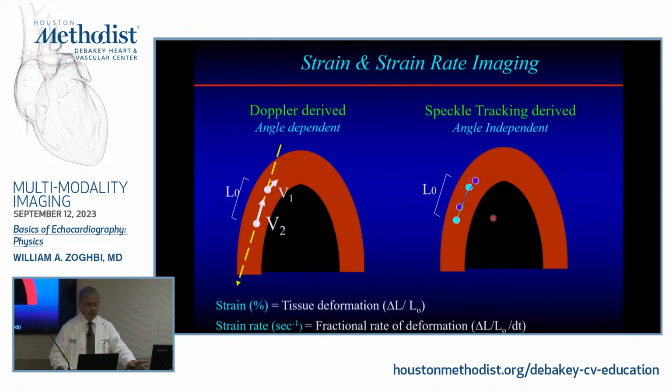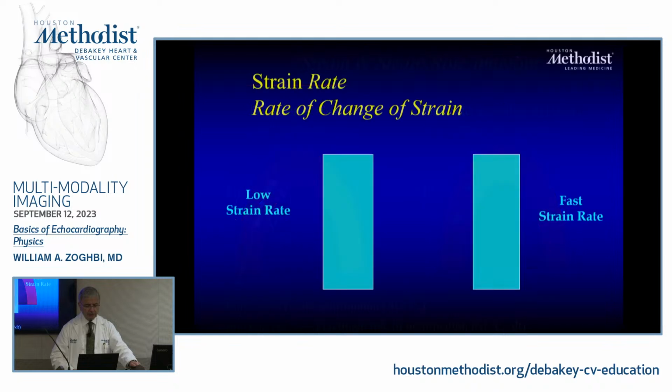Now, in the early days, we used Doppler to do that, changes in V1 and V2, but obviously it would be angle dependent, so we kind of dropped that, although there was a science about it almost 10 years. But nowadays it's mostly speckle tracking, which is angle independent, right? So you're following the speckles themselves of the structure itself and looking at changes from baseline to strain rate. We're not using it as much, and hopefully at some point in time, because it is much more noisy, it's the rate of deformation.